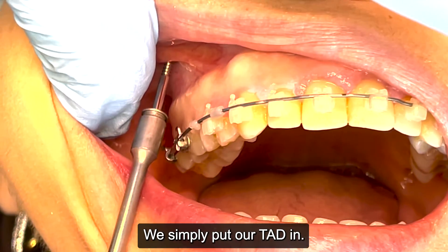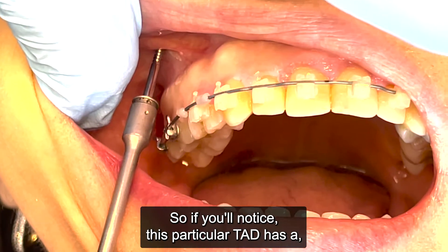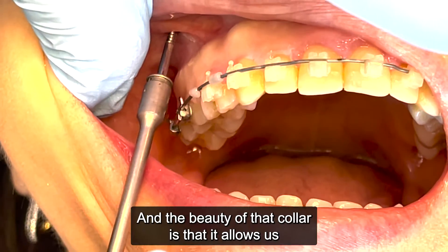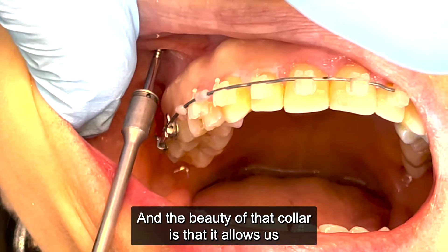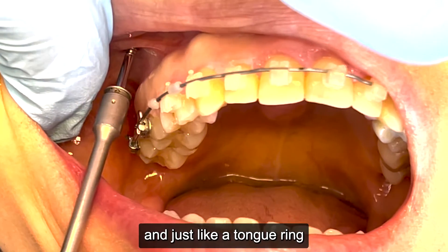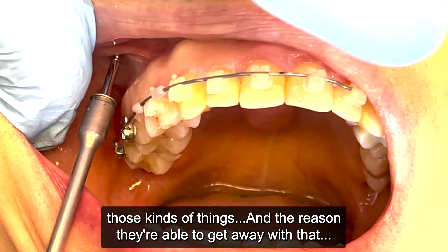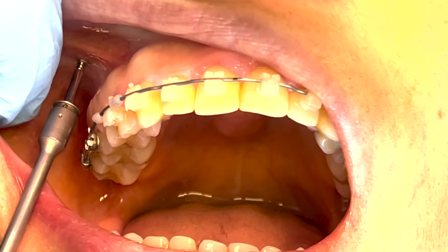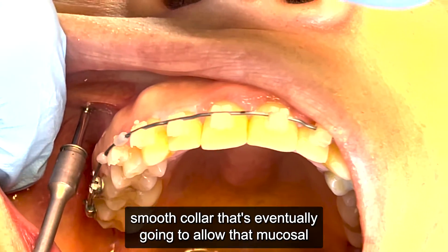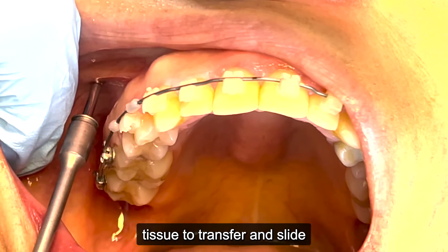Really nothing too exciting about this — we simply put our TAD in. This particular TAD has an extremely long collar on it. The beauty of that collar is that it allows us to put this TAD into mucosal tissue — just like a tongue ring, nose ring, or lip ring. The reason they get away with putting it through mucosal tissue is that they've got this nice long smooth collar that will eventually allow the mucosal tissue to transfer and slide along that collar.